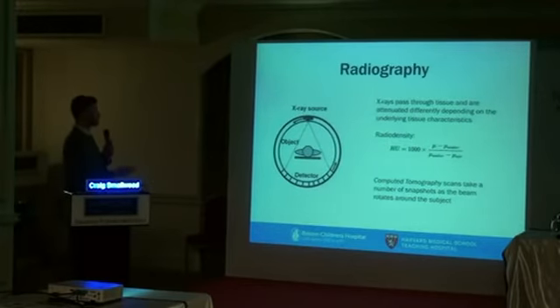An X-ray passes through tissue and it's attenuated at different intensities, and we look at the radio density. That's what we're actually looking at when we interpret chest films or CT images. It's the radio density. And the Hounsfield unit, if you work closely with your radiologists or look at chest X-rays really closely yourself, is the unit of that density. And so what a CT scanner does is you stick your patient inside the cylinder.